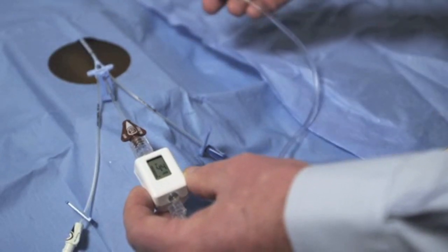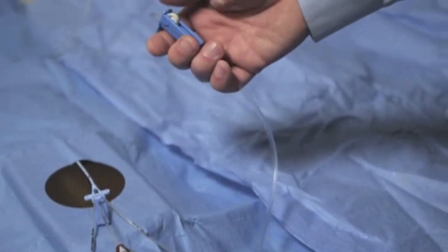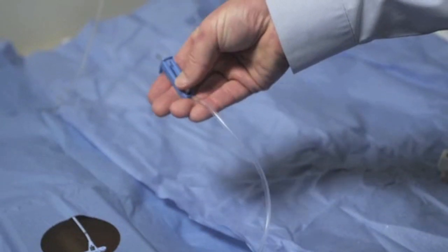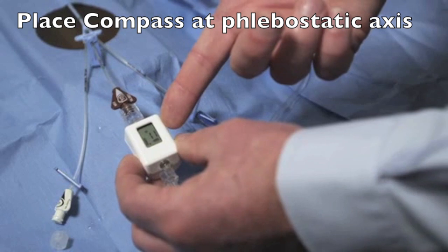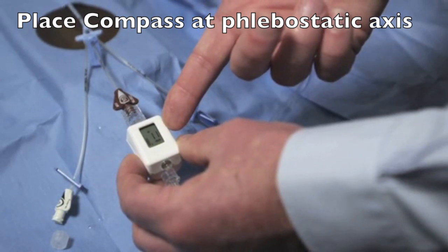When it's desired to monitor the patient's central venous pressure, simply close the fluid infusion, wait several seconds, and the Compass will once again display the patient's central venous pressure.